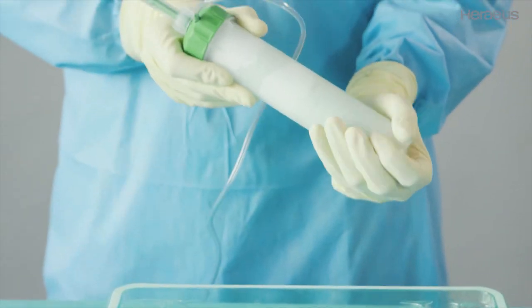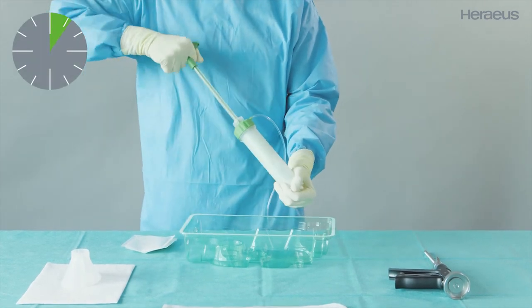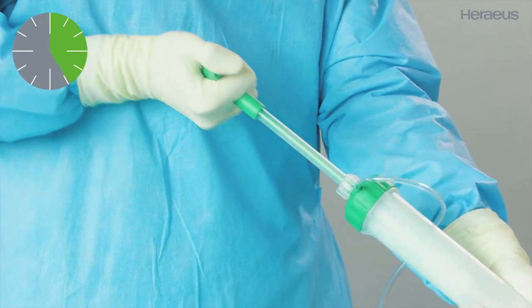Now start the mixing process. Mix the bone cement by steadily moving the mixing rod up and down the entire length of the cartridge for at least 25 to 30 strokes, with one stroke per second, until a homogeneous dough develops.